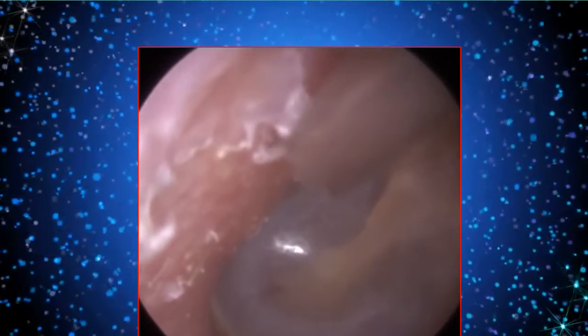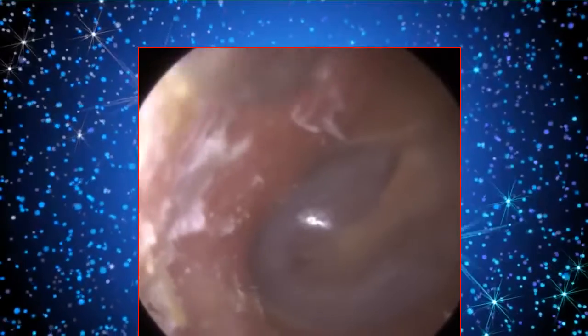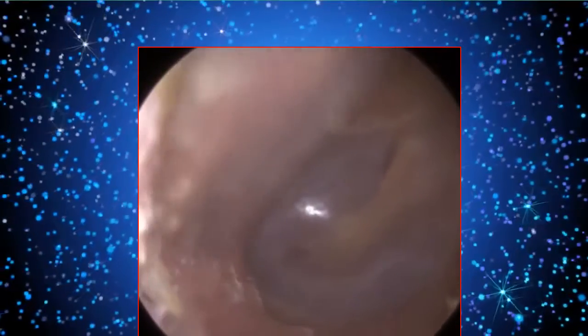The last thing we want to do now on the bony part is make contact with the canal wall. On the outer cartilaginous portion, you can see I was putting a bit of pressure trying to lift the skin off. That's because the cartilaginous portion is not as sensitive as the bony part of the ear canal. It's a bit more flexible, and we have some fatty tissue there sometimes as well.